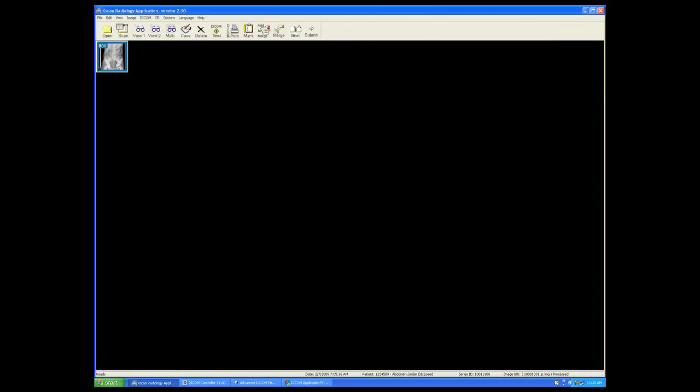One minute later, this will now change from 001 to 001.ds, DICOM send, documenting that we have indeed made a successful send of that image to the target.